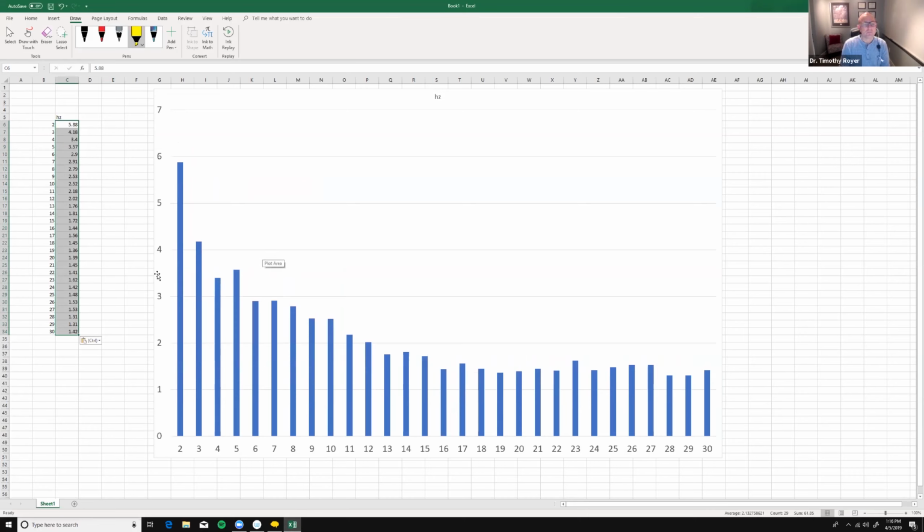Now, what you should be able to see here on the screen is all the different frequencies. We're missing a few, but just for the sake of our discussion today, I threw a few up on the board. Don't have them all, but the slow frequencies are sitting over here.